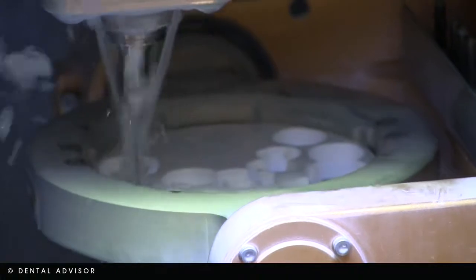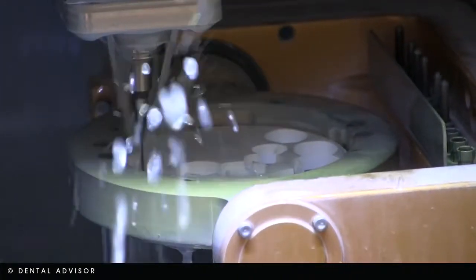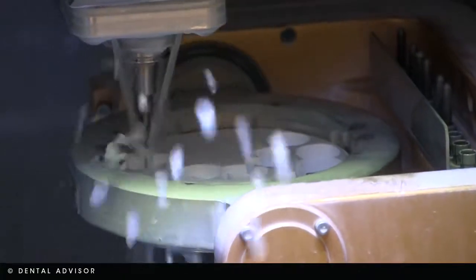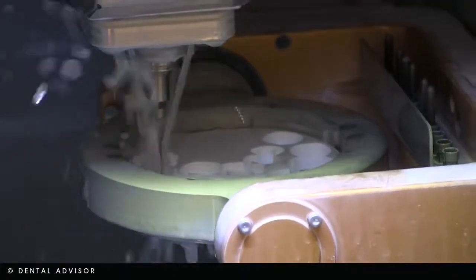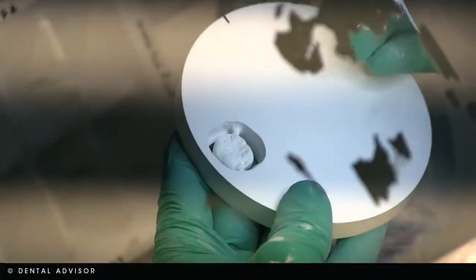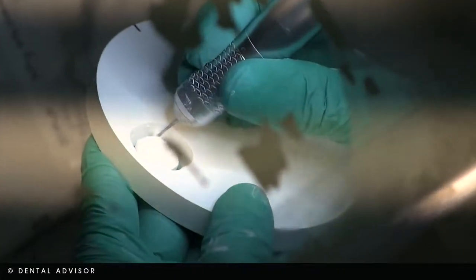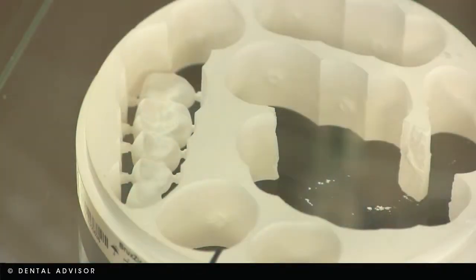That unit is then cammed and sent to our mill, where it is milled. Milling takes a variety of different times depending on how big the unit is or how many we're doing in that puck. After milling, the unit is cut out under a microscope.